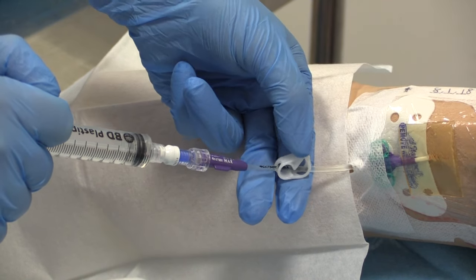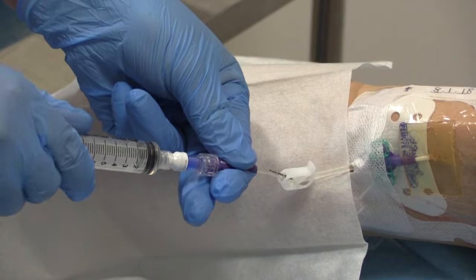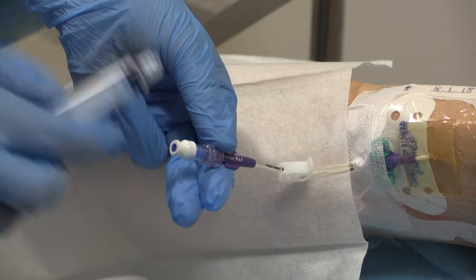Whilst the last 1 to 2 mils has been injected, re-clamp the line. Whilst flushing, view the exit site for leaks and ask the patient how the flush feels.